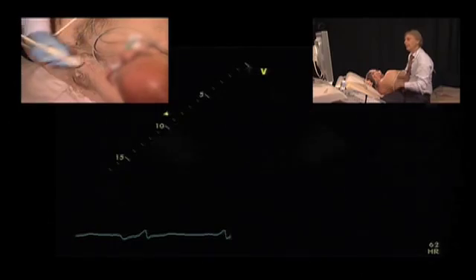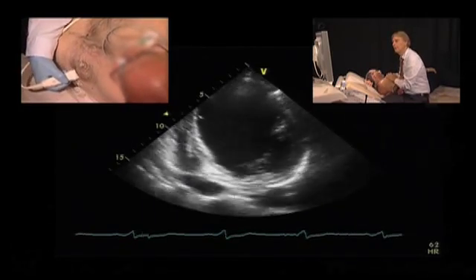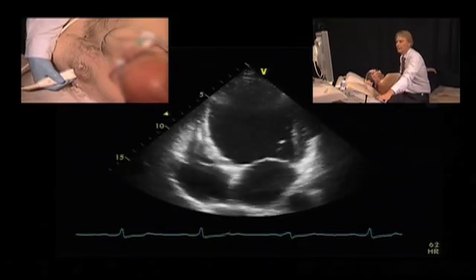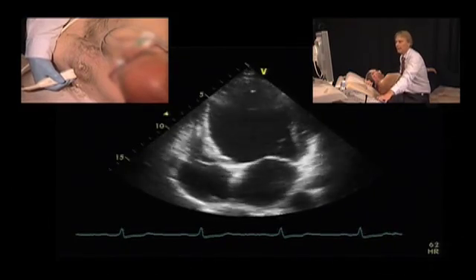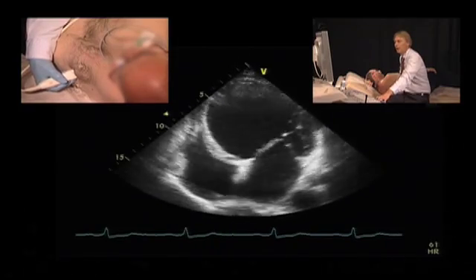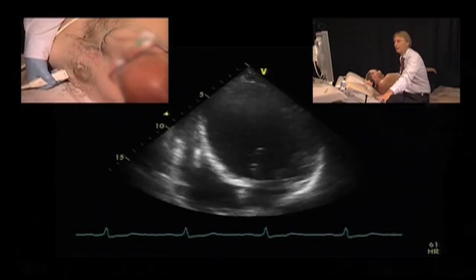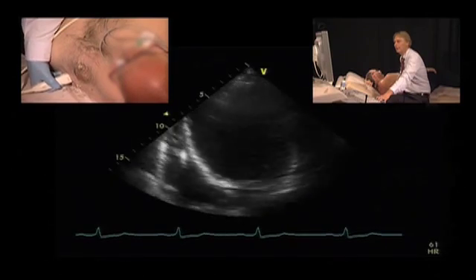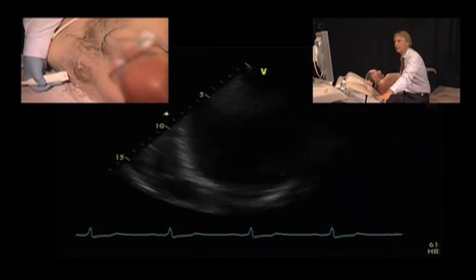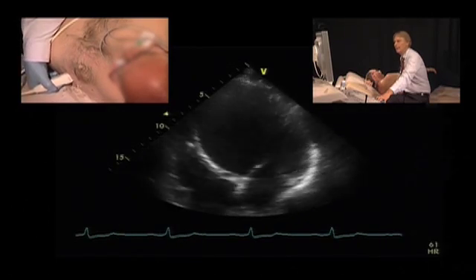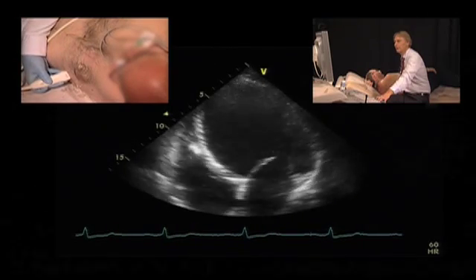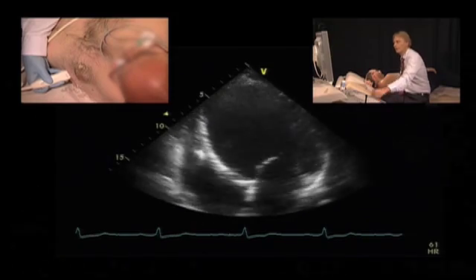Let's now turn to the apical views. This is the apical view where we get a very nice image quality. However, the problem we have in this view is that we are not truly at the apex, and that we have some degree of foreshortening. So to optimize this view, I would probably go one intercostal space further down. The trade-off is that I do lose image quality. Nevertheless, if you perform volume measurements, you should try to use the imaging plane which gives you the largest ventricle.